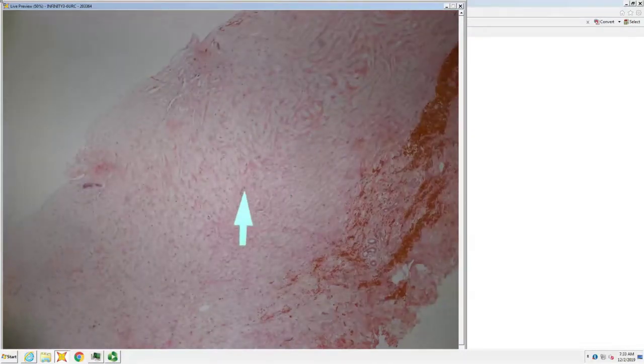Sclerotic from top to bottom. Yeah, it's very sclerotic. It has a little bit of a starry night pattern. So sclerotic fibroma, which can be a marker for what syndrome? Cowden's. Cowden syndrome. So starry night pattern, sclerotic fibroma, you think Cowden syndrome, and then what do people with Cowden syndrome get? Breast cancer, thyroid cancer, so important to know for that reason. Okay.